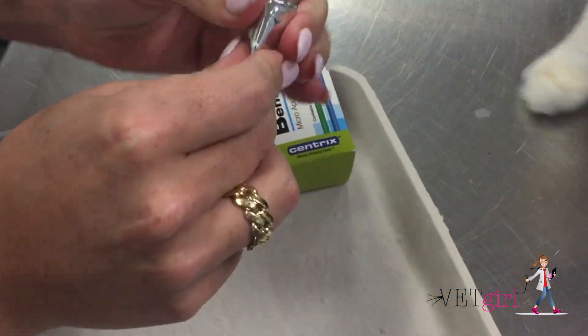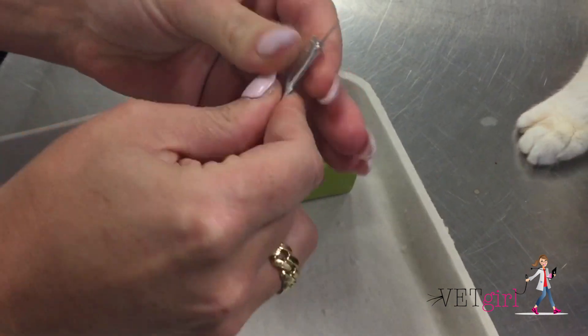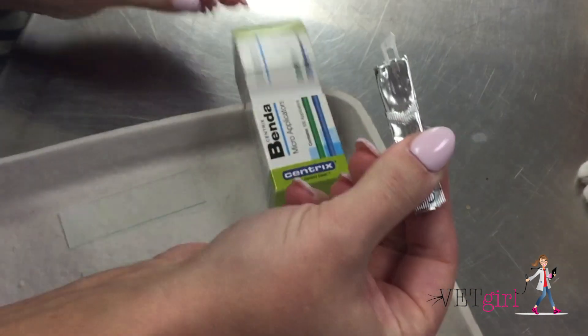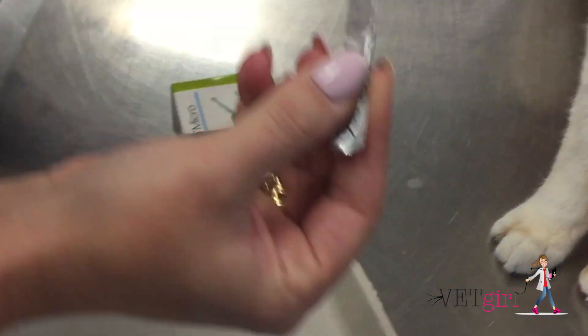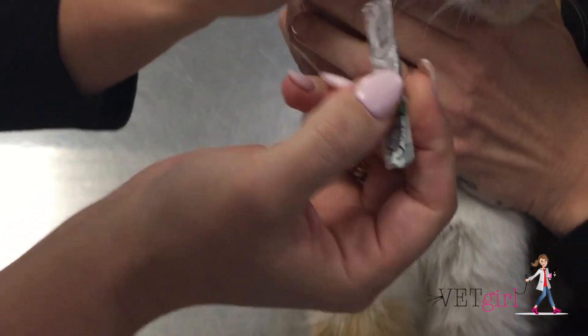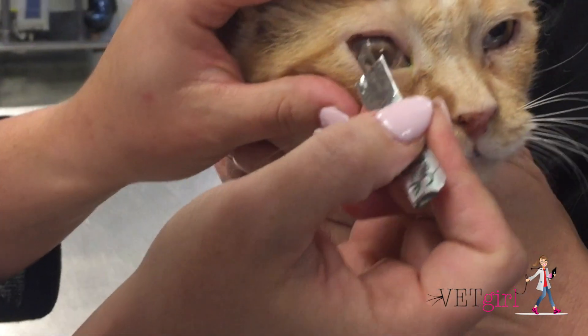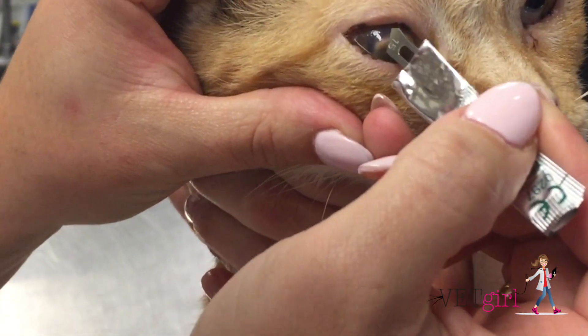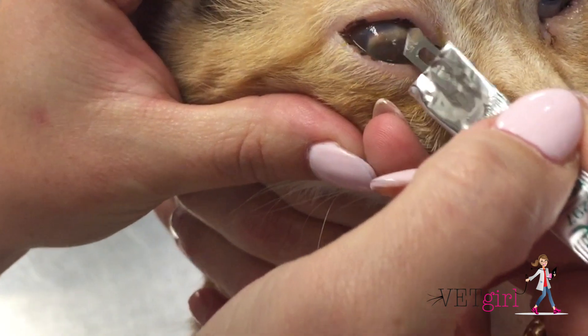The first step to obtain corneocytology is to make sure the patient is comfortable and amenable to collection. In the vast majority of cases, topical anesthesia with proparacaine or tetracaine is sufficient.